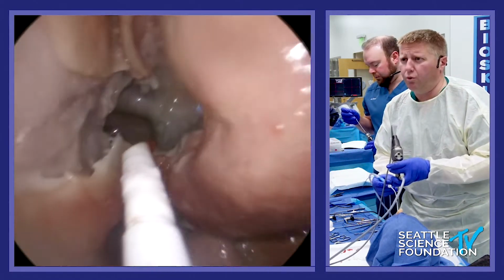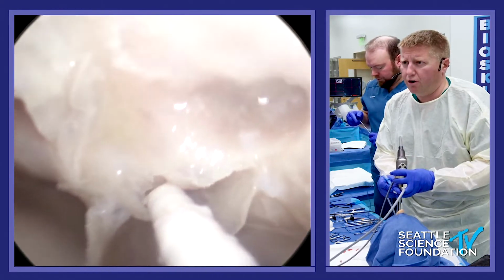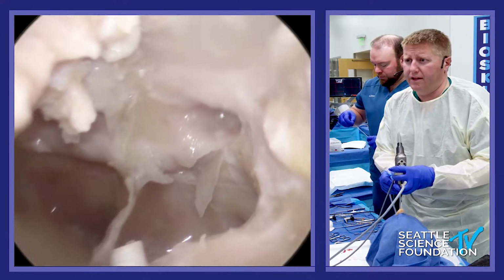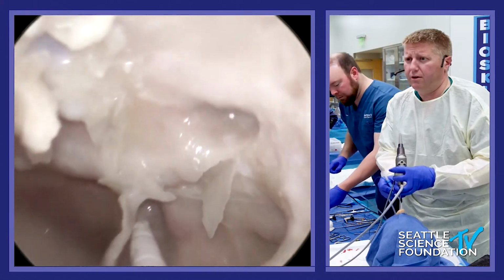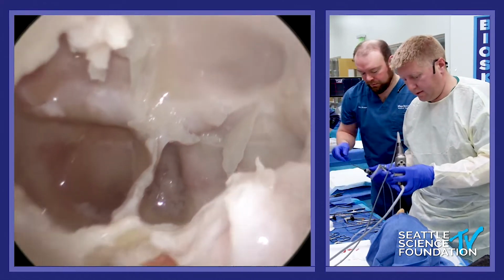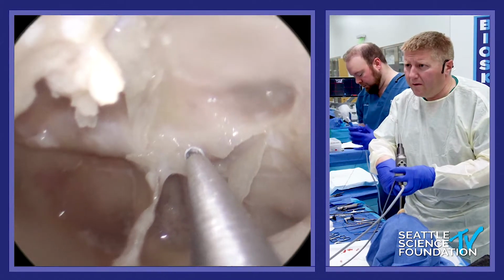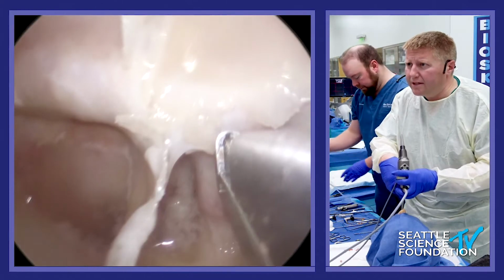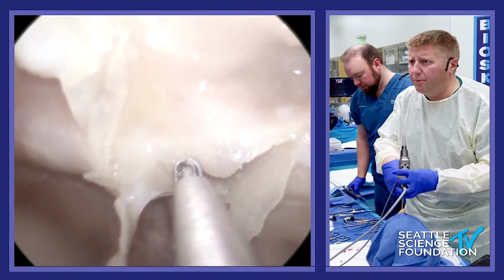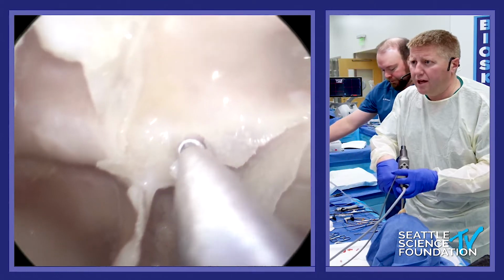And once you get a little window into there, well, then you can start opening it up further with things like, could I get a kerrison, please? Oh, great. Thanks. And you can see how thin this bone truly is. There's not much there.